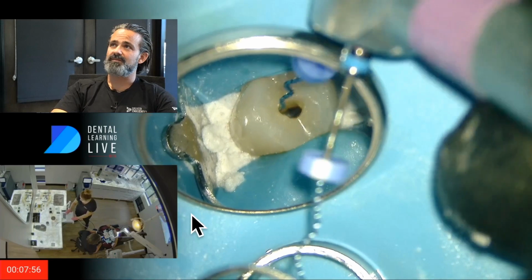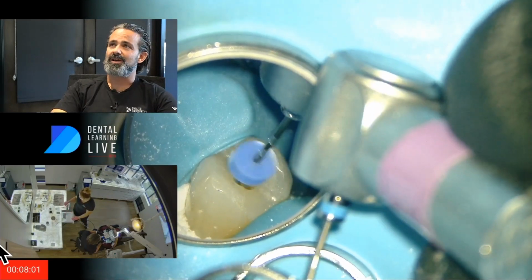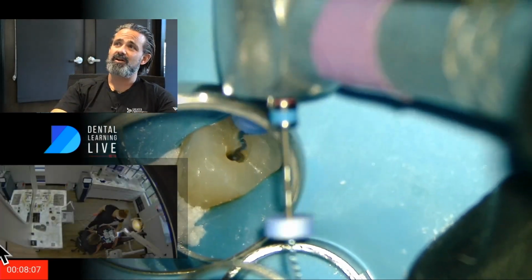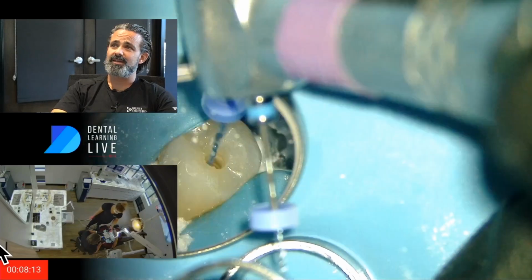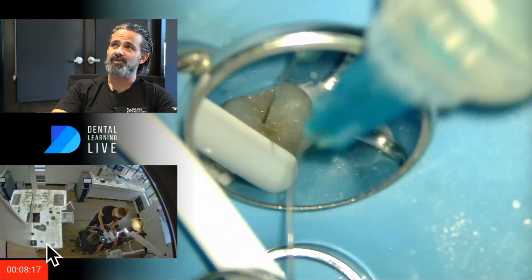And so what I've done, because I can perceive that, and these canals are pretty big, it wasn't until the terminus that I was even twiddling with that file. I decided to go right to the 3D shaper because I could. I'm going where this goes, and that's really all the instrumentation I'm going to do.